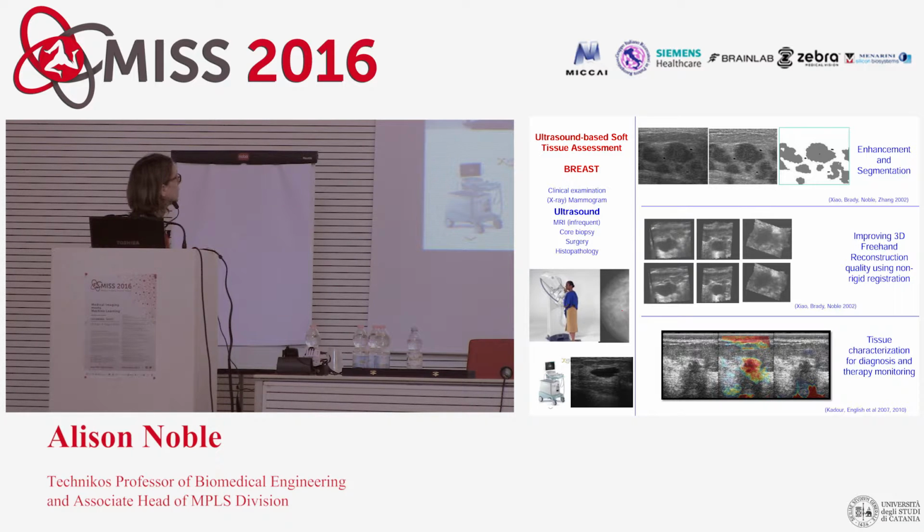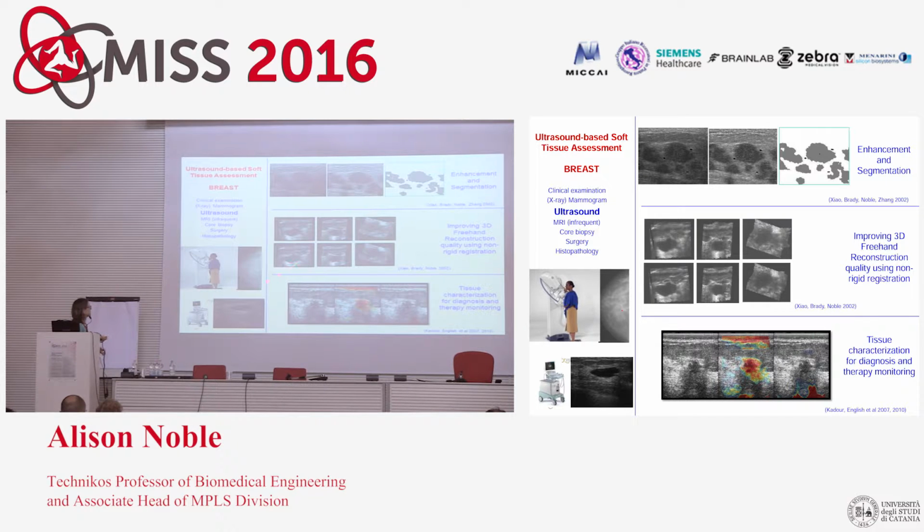And while you can look at ultrasound, and some of the things we've done in the past is look at segmentation of masses, look at reconstruction. This is freehand ultrasound, where it's a 2D probe, you track, you reconstruct in 3D, and then you can visualize the mass to try and get a notion of its size.